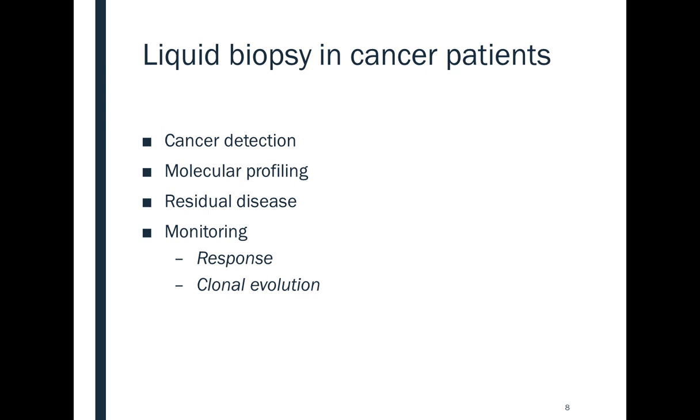Liquid biopsy analysis in cancer patients is much more difficult to standardize. The amount of released tumor DNA depends on the tumor entity, disease stage, or tumor burden, and also the microenvironment of the tumor. For example, the access to blood vessels, etc. As a consequence, the circulating tumor DNA could vary a lot between patients, even in the same disease stage. That makes it so difficult to standardize circulating tumor DNA analysis in a routine lab.